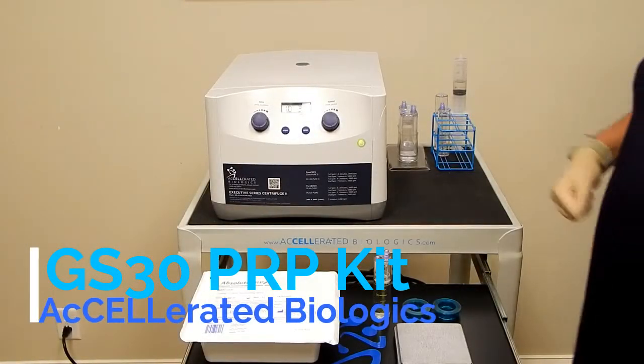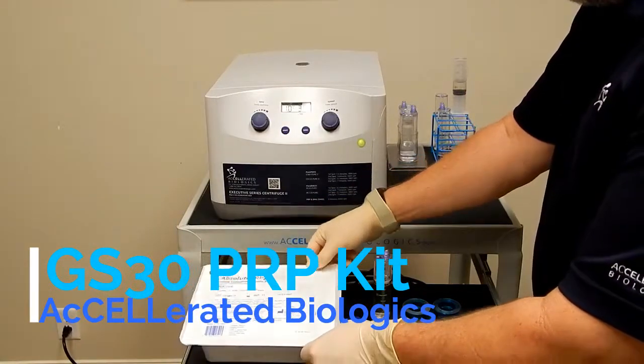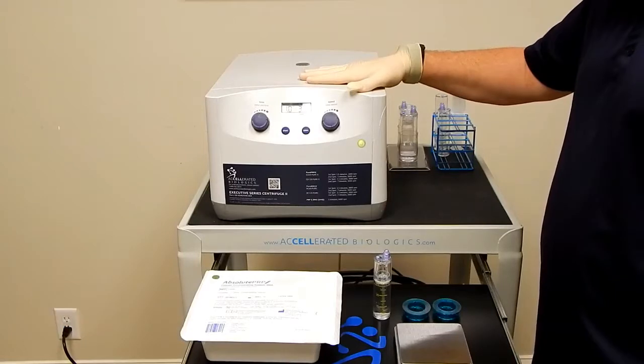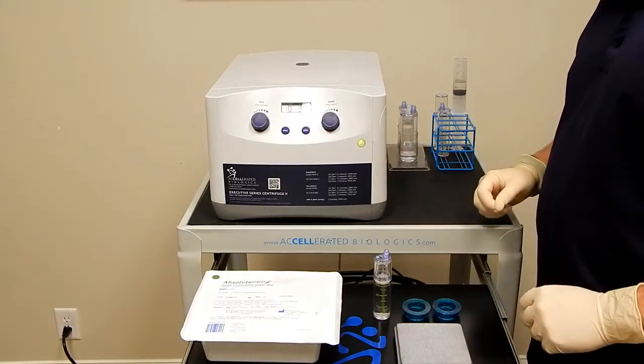Hello, we're going to be going over the M-Site GS-30 PRP kit today. Items you will need to process this kit are your Executive Series Centrifuge, Counterbalance, Bucket Inserts, and Scale.